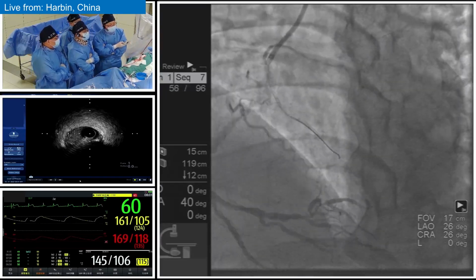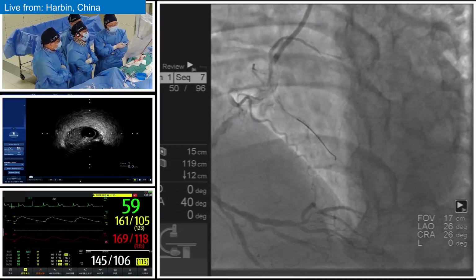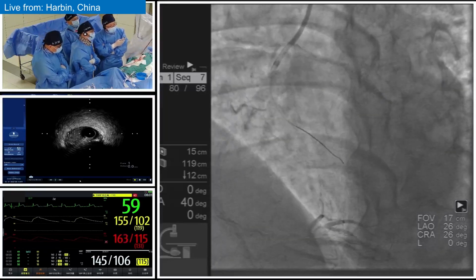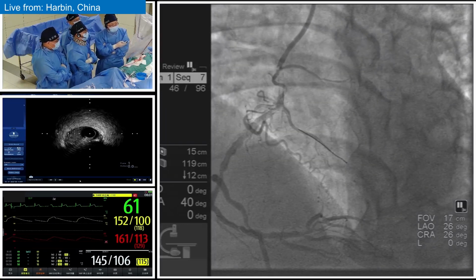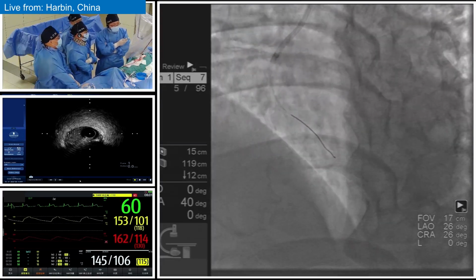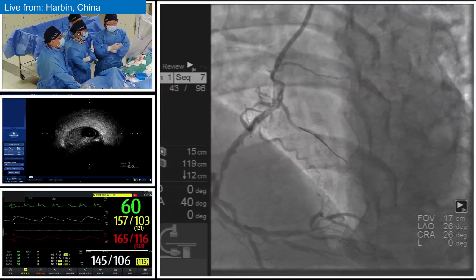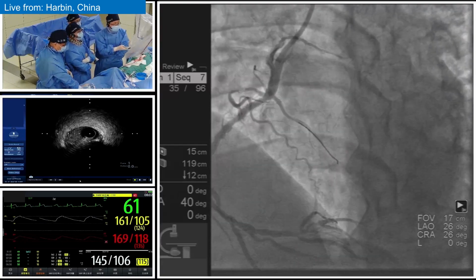In the RCA angiogram, we can see some collateral channel to the distal RCA, with diffuse lesion, especially in the third portion segment. There should be maybe a relatively unstable plaque there. We can see clearly. So if we use retrograde approach, we may firstly use imaging to check the place, and maybe implant a stent there, to make the retrograde approach safe.